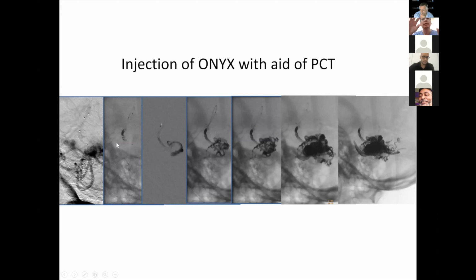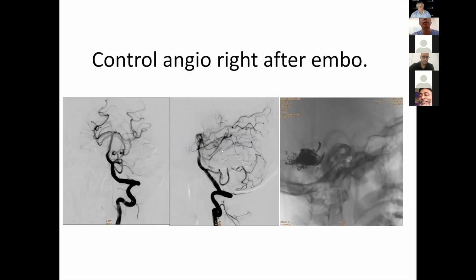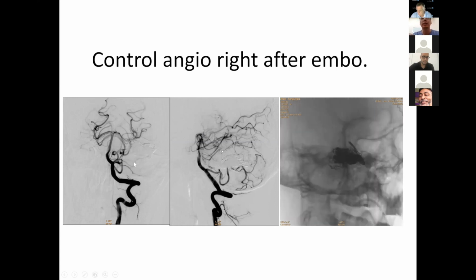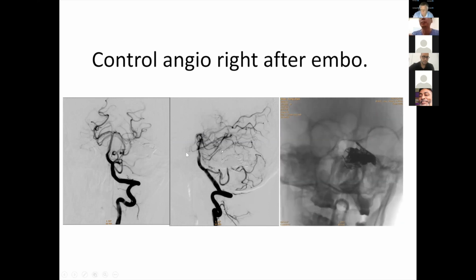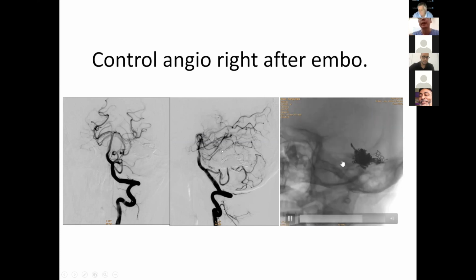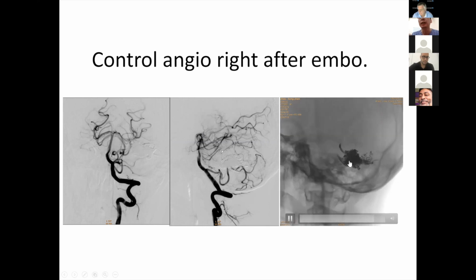I made a high pressure cooker technique. You can see very clearly, and then I inject Onyx, and I achieved the cure. The total cure of the AVM nidus. You can see the control angio right after embolization is very clear, 100%. It is cured.